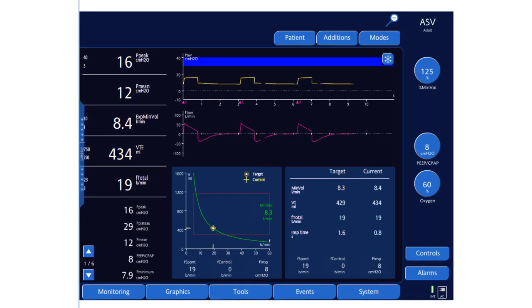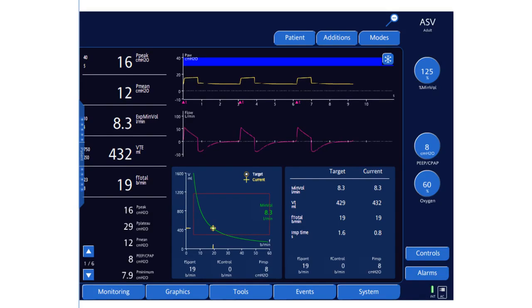The pressure is now down to 8 cmH₂O and we are almost at the target. You can see how this patient can be weaned gradually — as inspiratory efforts improve, the pressure support level gradually decreases, and the patient will be ready for extubation.